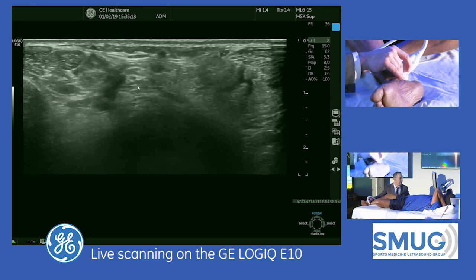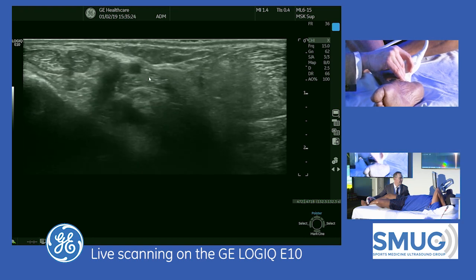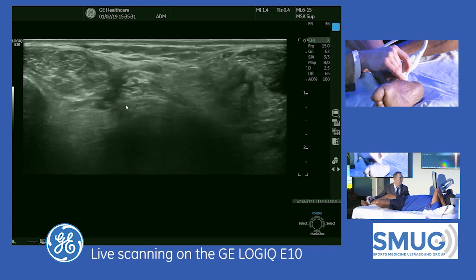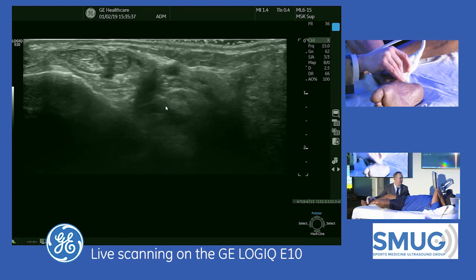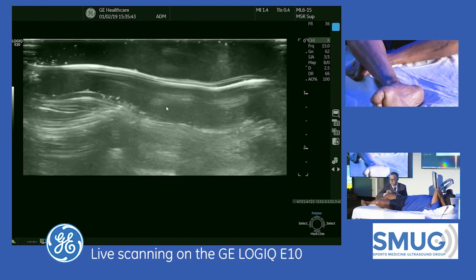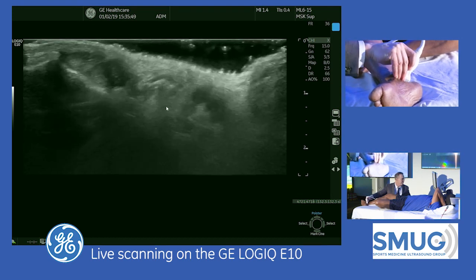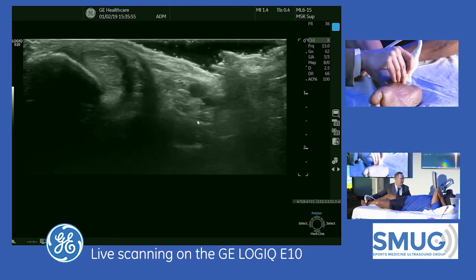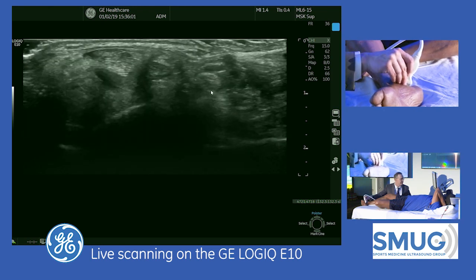As I go distal, a little branch already comes off — that's the medial calcaneal branch, coming down to arborize. Meanwhile, the tibial nerve is going to bifurcate into the medial and lateral plantar branches. Back here it's already starting to arborize into two different branches — medial and lateral.